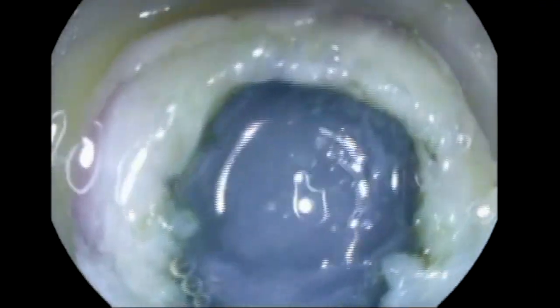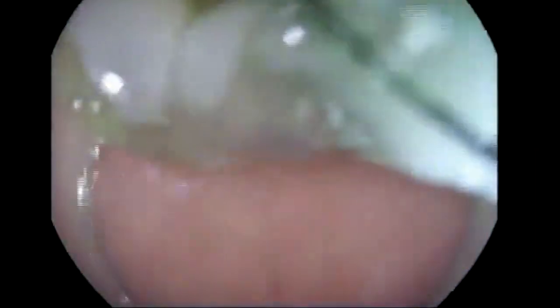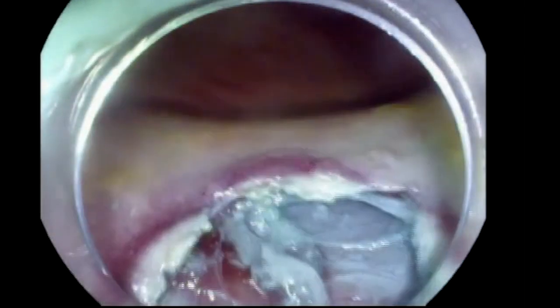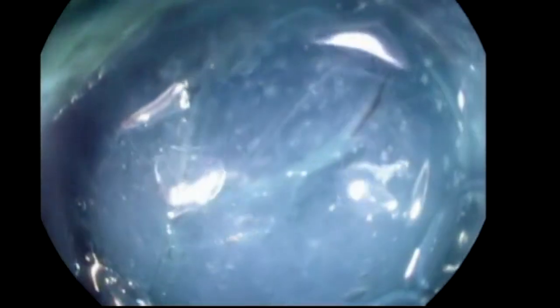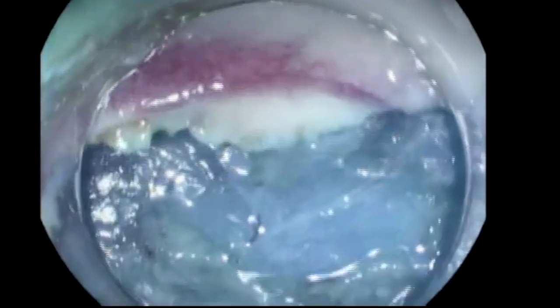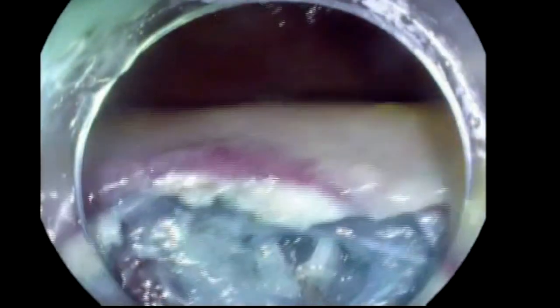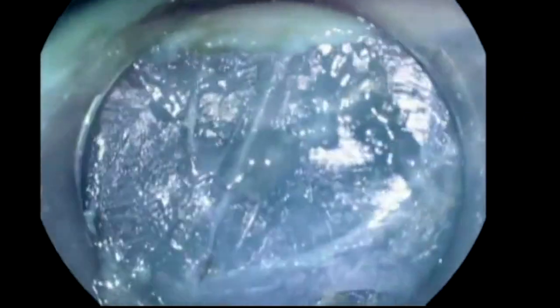As you see here, once I made the mucosal incision or entry point, I'm trying to put my scope through by sliding my cap, but it is not working. So I will continue to dissect in the submucosa — the more we dissect, the easier it opens. You have to be careful to dissect the submucosa and not extend your mucosal incision. One of the most common mistakes is that people keep extending the mucosal incision without dissecting the submucosa. The idea here is to make a tunnel, not to continue the mucosal incision.